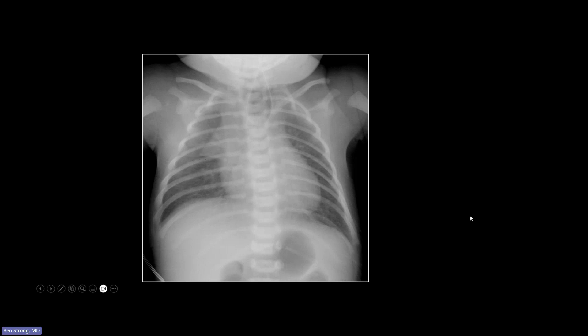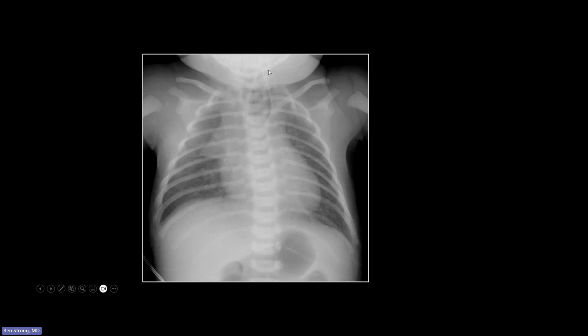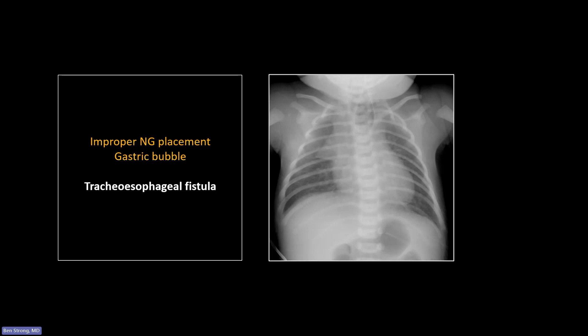We also have inappropriate placement of an NG tube — note how it's looping here in the proximal esophagus. Your immediate concern should be esophageal atresia. When you make that diagnosis, the next place to look is the gastric bubble. If you have complete atresia of the esophagus, there really should not be a gastric bubble unless you have an associated tracheoesophageal fistula, which is the case here. In that case, you often have a rather hyperinflated gastric bubble, suggesting the final diagnosis of a tracheoesophageal fistula — those form a route by which gas can get into the stomach.